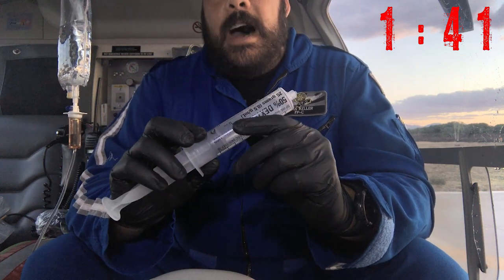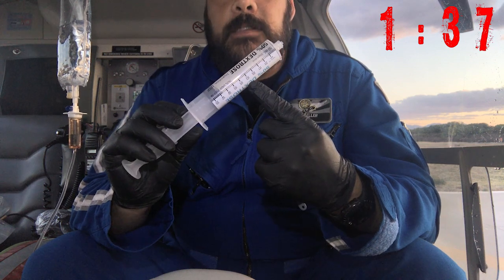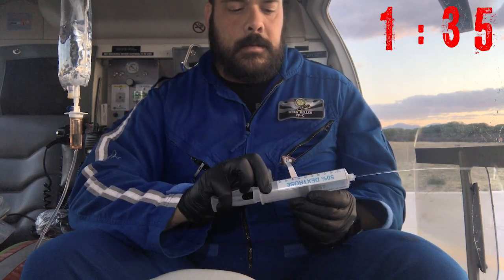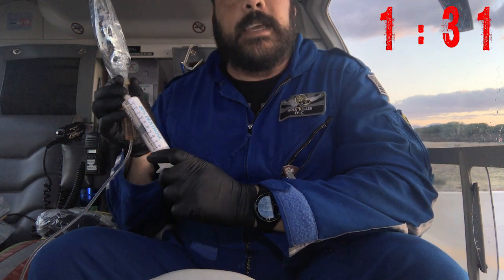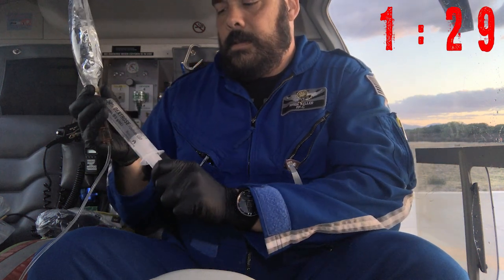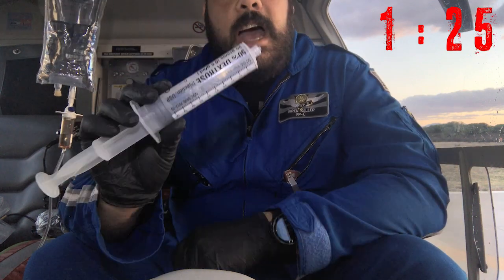To make D25, discard 25 mils from your Amp D50. Draw up 25 mils of normal saline, agitate your syringe, and now you have D25.